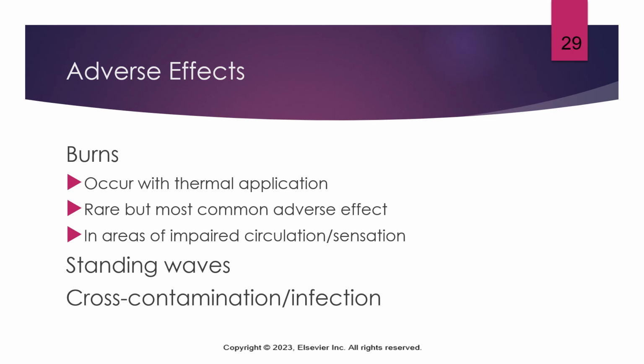Some of the adverse effects that you want to be aware of. Burns especially is kind of the big one here that occur with thermal application. So let your patient know that this should be warm, it should not burn. You should also not feel this dull aching sensation because that again is at a risk for periosteal burning.